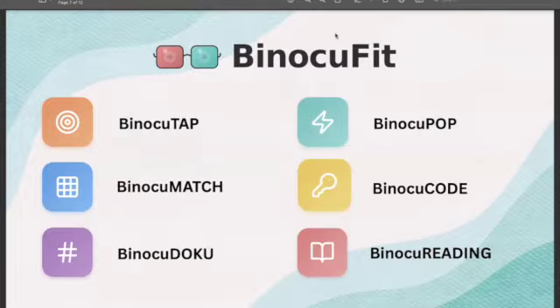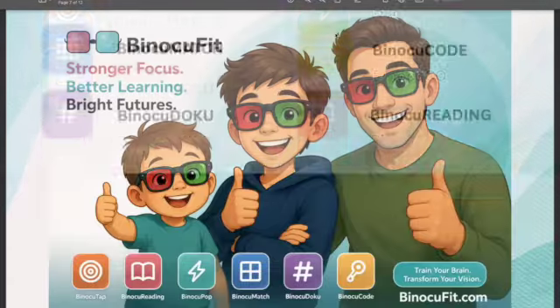And I've been able to find ways to engage many teenagers and adults, which I've also struggled to find, those home activities that might give them a sense that they're not playing a kid game or that they can sustain their attention with for long enough and those types of things. So it really has filled a little bit of a gap there for me as well.